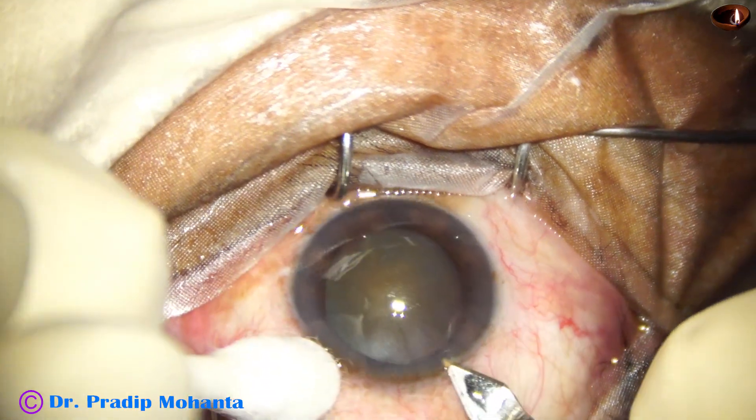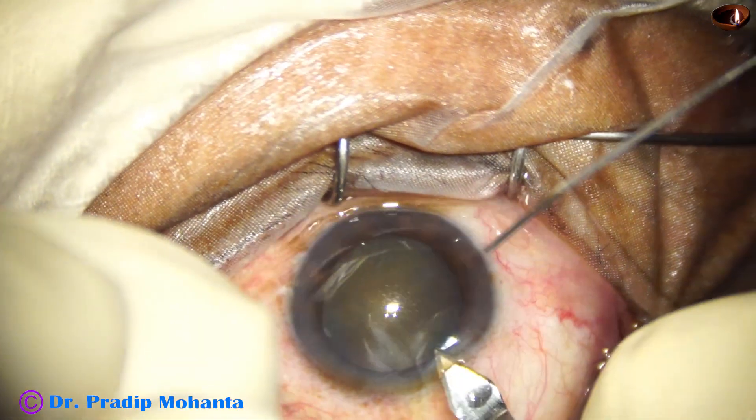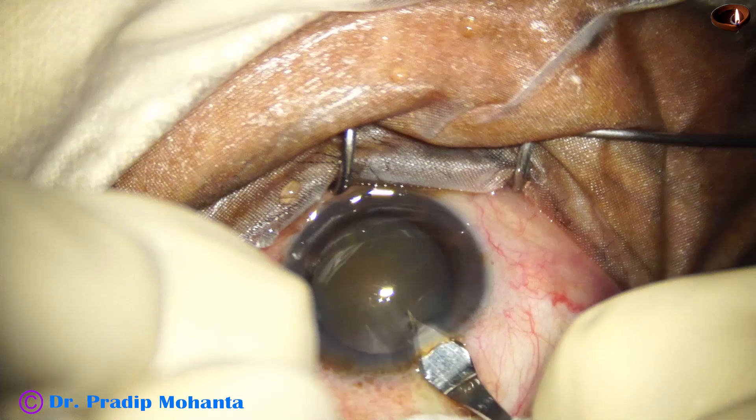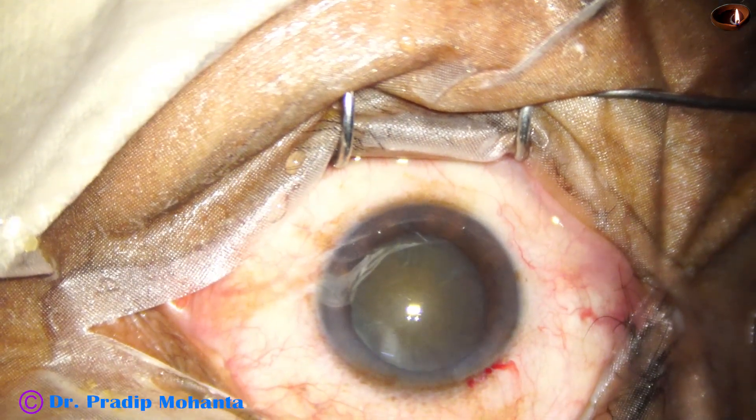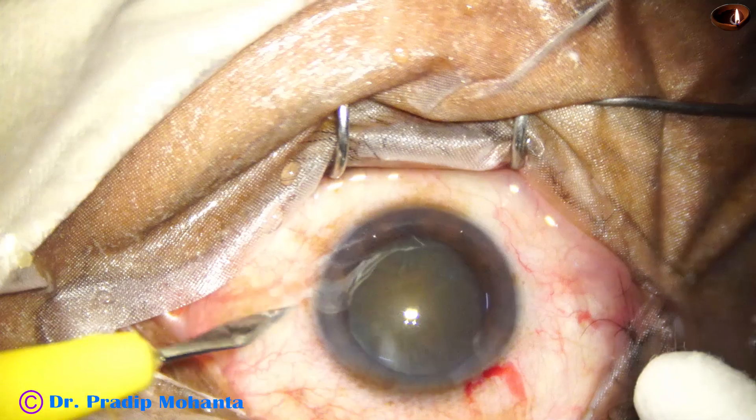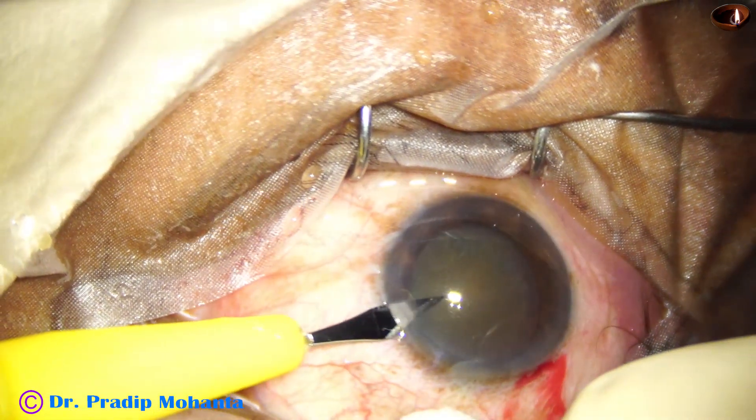Welcome to my workplace at Ranaghat, West Bengal, India. Let us observe this totally unedited surgery. This is the main incision with a 2.8 millimeter steel keratome. This is a side port on the left side of the main incision, about three clock hours away.